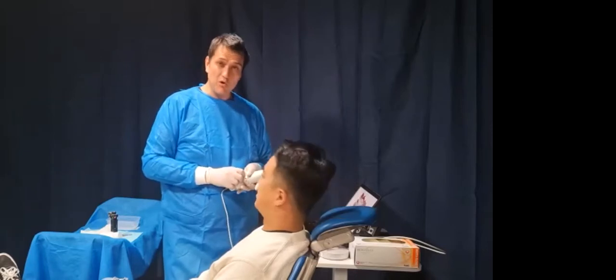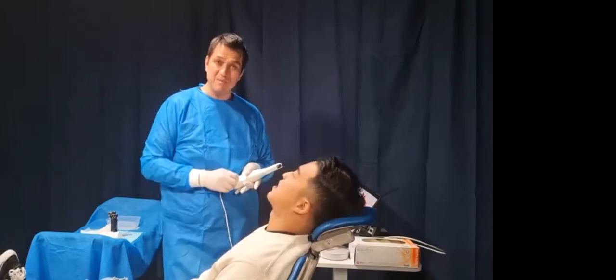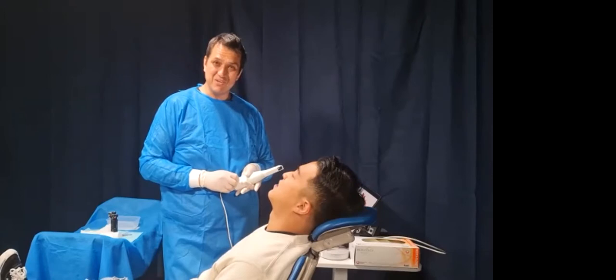Thank you, Mr. Patient. We'll just give a bit of a wipe down, and we'll come back in a moment and we'll do the next step. Thank you.